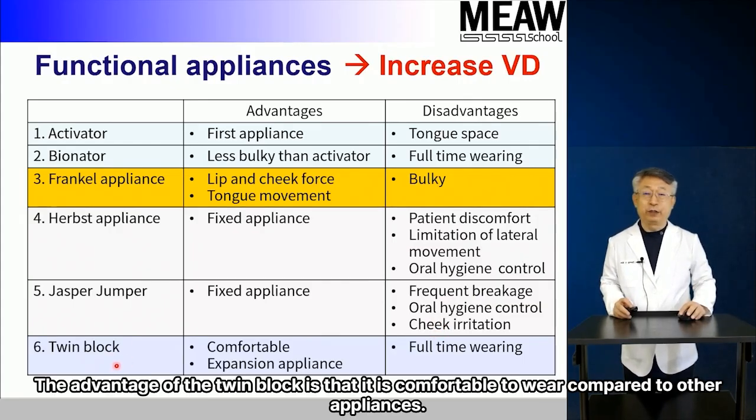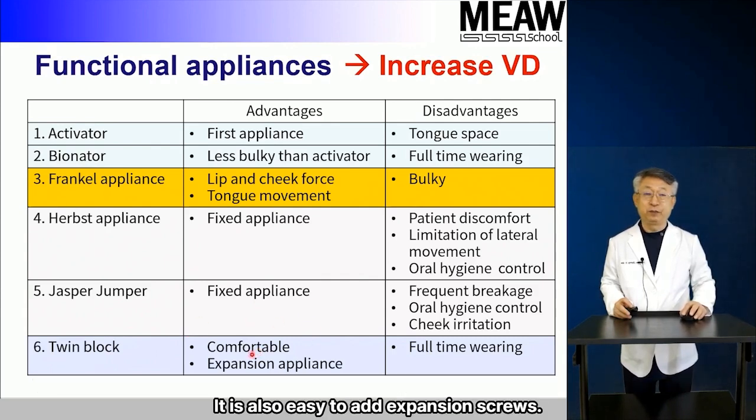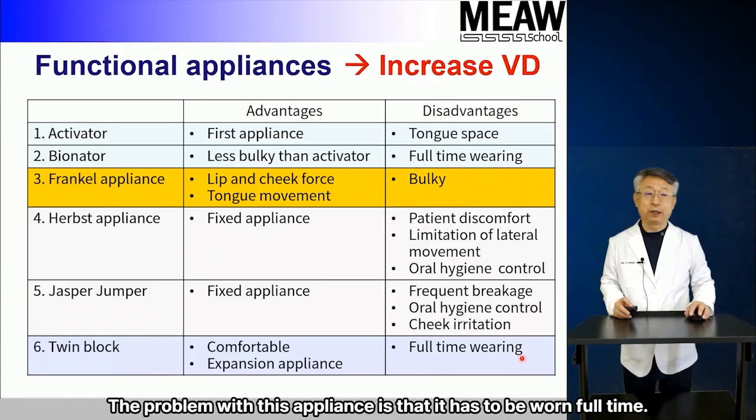The advantage of the twin block is that it is comfortable to wear compared to other appliances. It is also easy to add expansion screws. The problem with this appliance is that it has to be worn full-time.